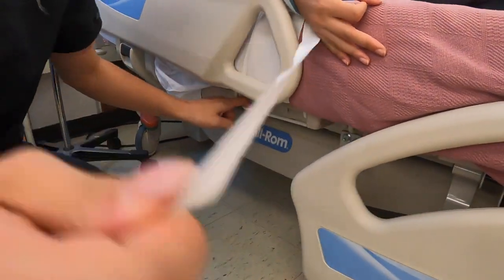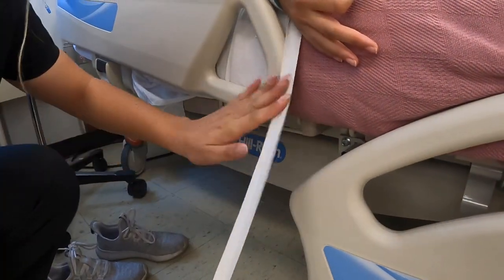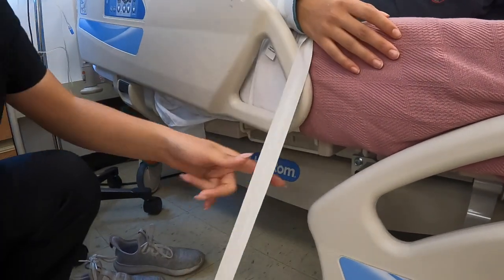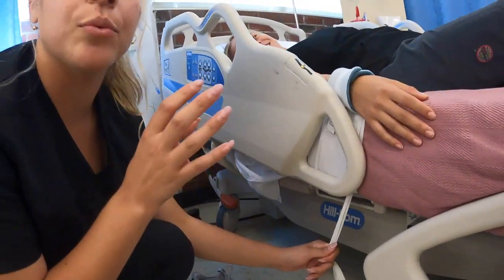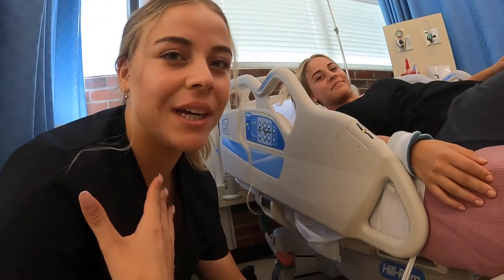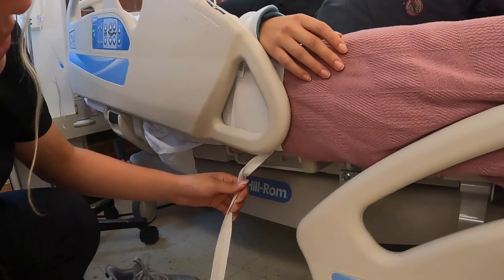As you can see right here, there is a metal railing and this is where we want to tie the knot, just because these bed rails go up and down and we want the knot to tie away from the patient so they don't untie themselves.